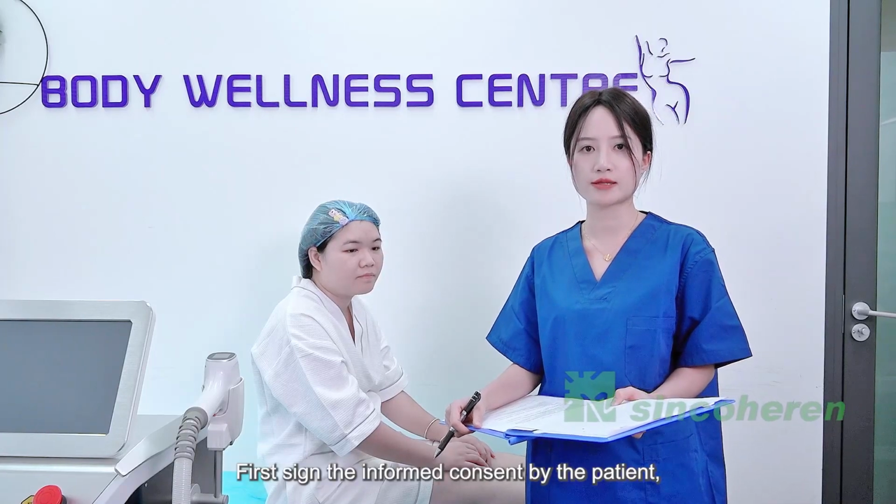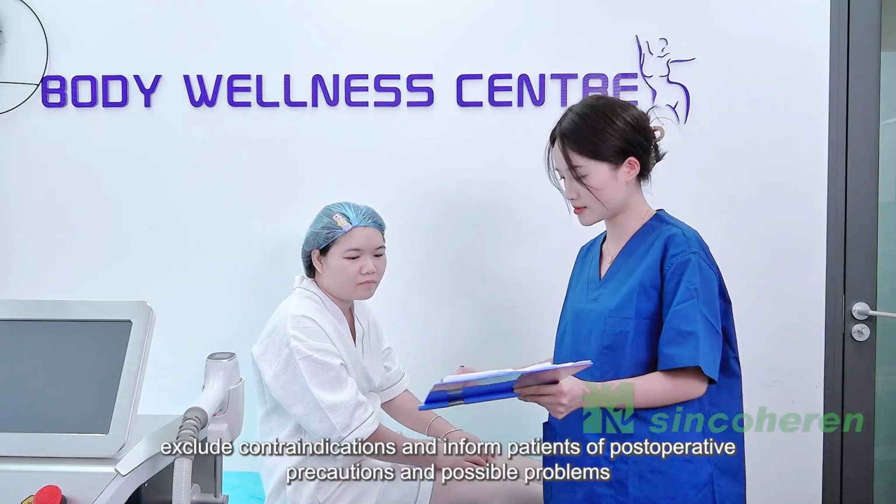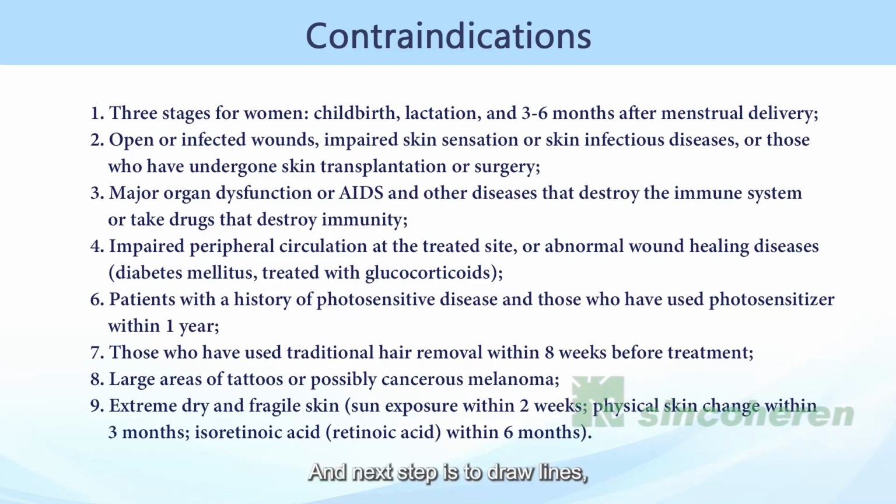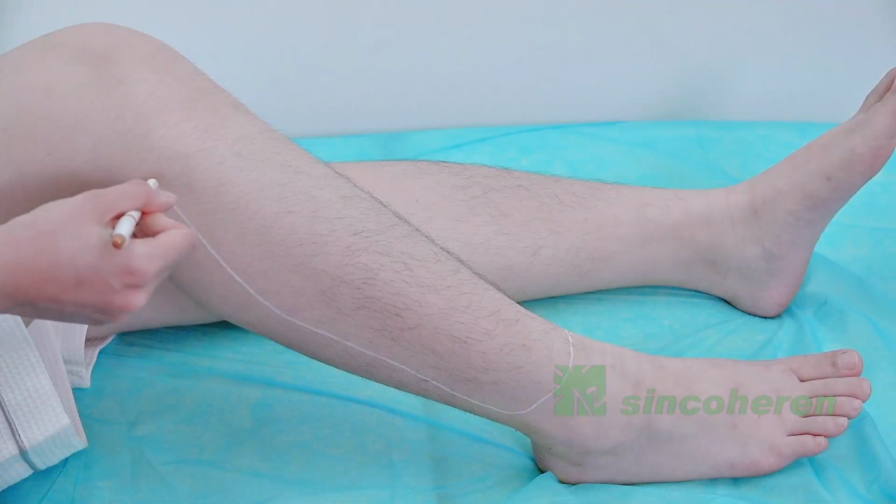First, sign the informed consent by the patient. Exclude contraindications and inform patients of postoperative precautions and possible problems. And the next step is to draw lines.